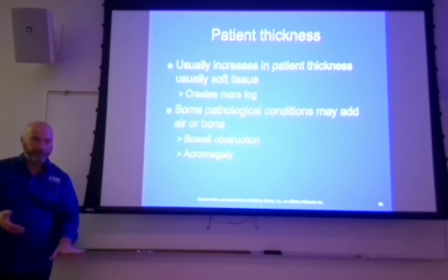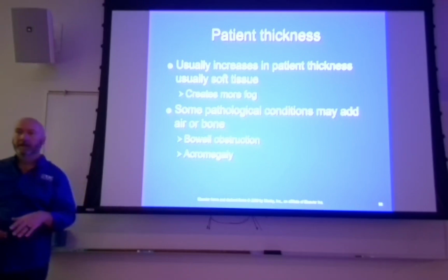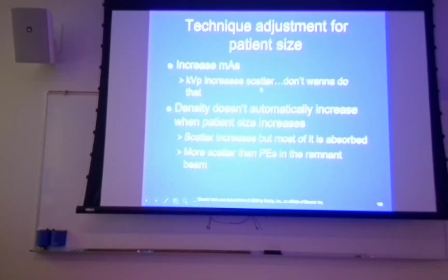You ever mashed on memory foam? It doesn't just bounce right back up, it kind of reinflates. So if it comes back like a memory foam, that's an indication the patient's full of fluid, and you would need to increase your mAs in that case. So technique adjustment is still typically mAs.